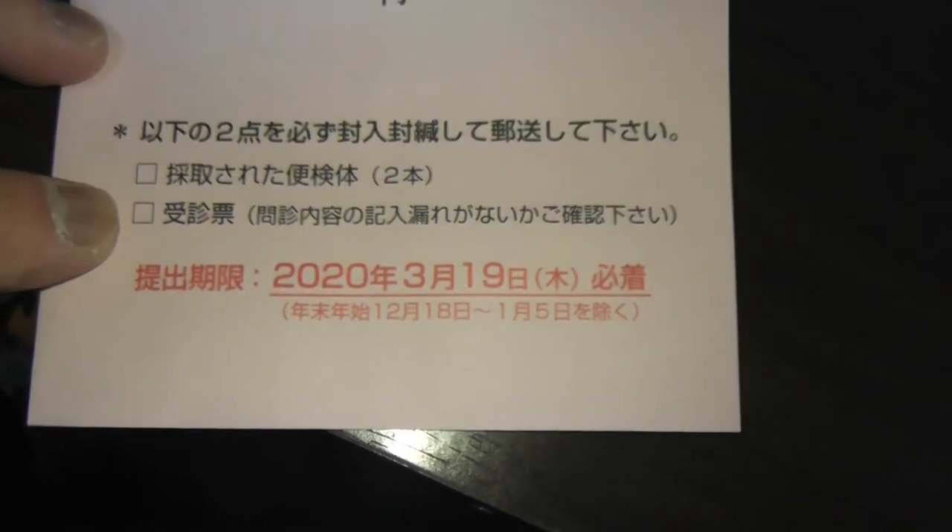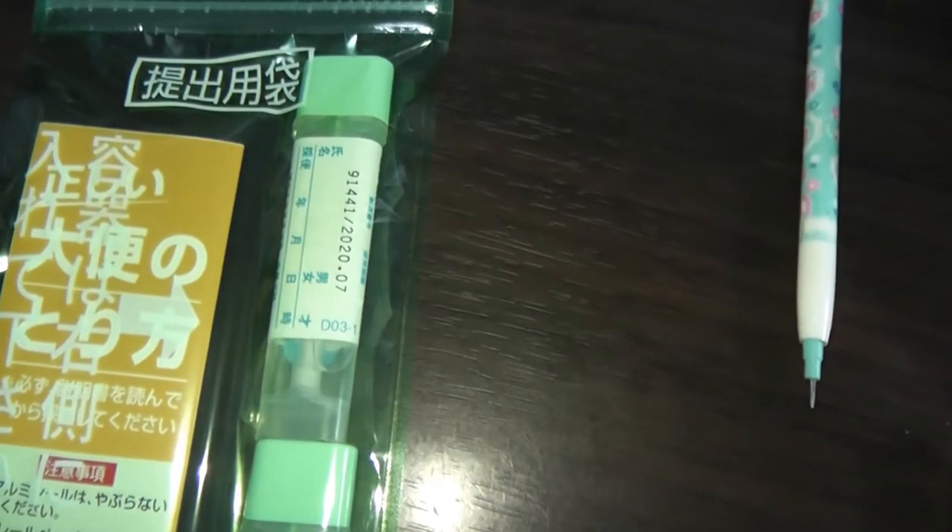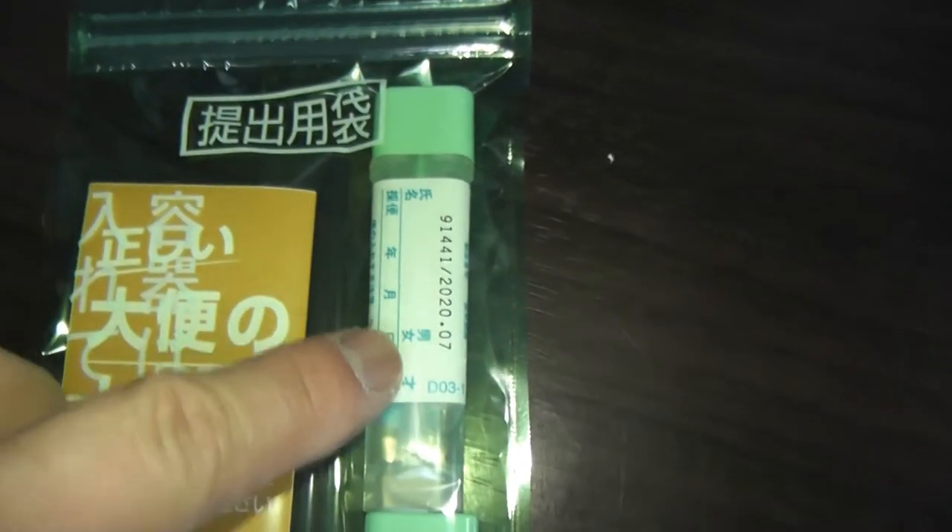Tick off these two boxes to make sure that you have the entire kit with the vials. These are the two vials in this green little package — vial one and vial two, for two days.